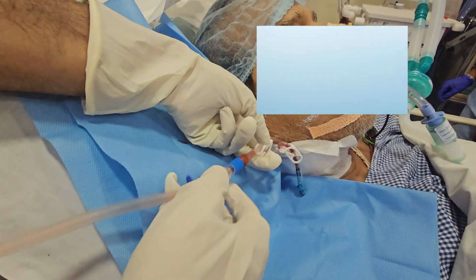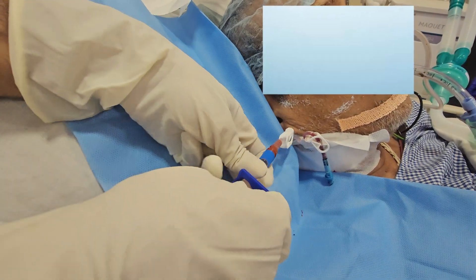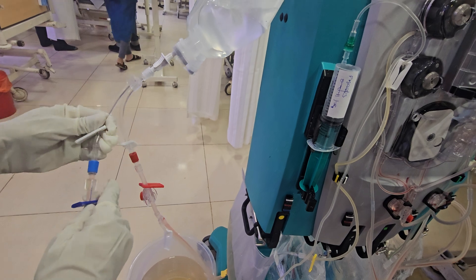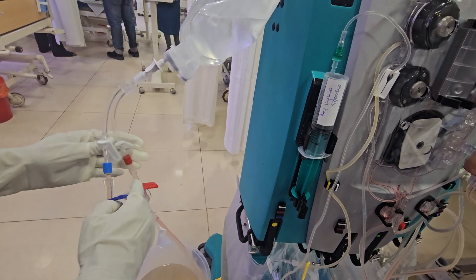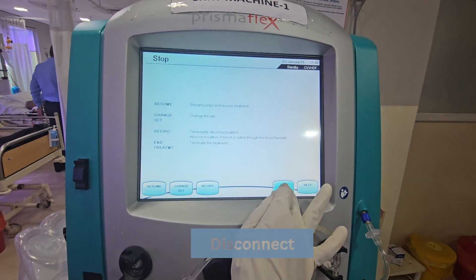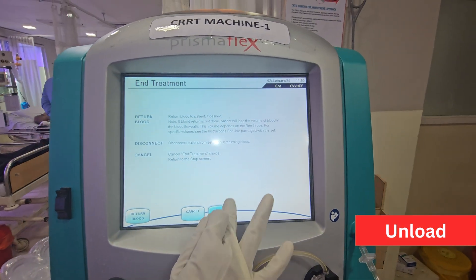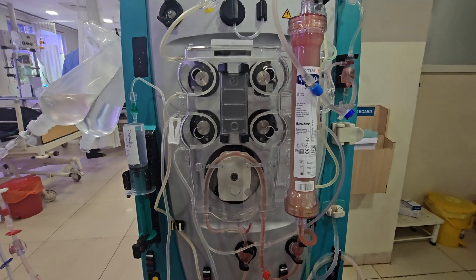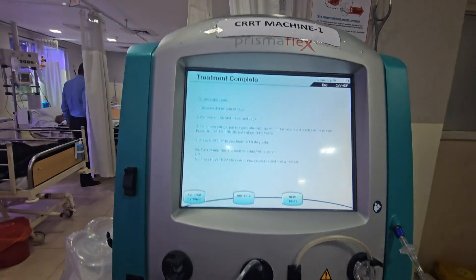Discontinue the blue return line and connect to the prime bottle. Press End Treatment. Disconnect and unload. Treatment complete.